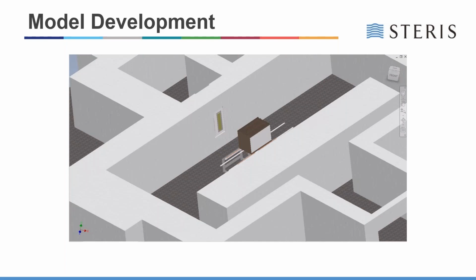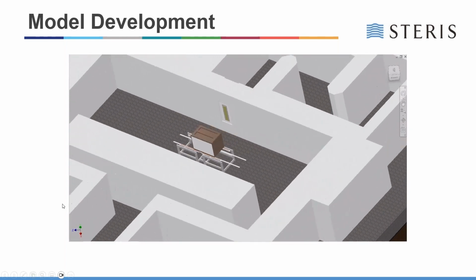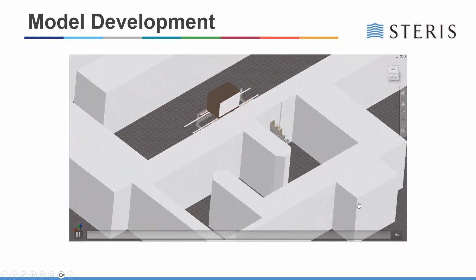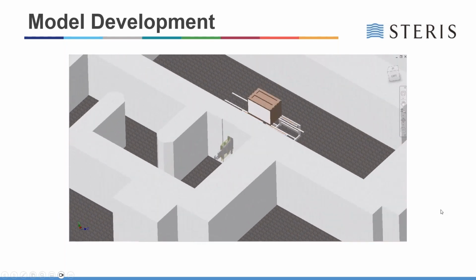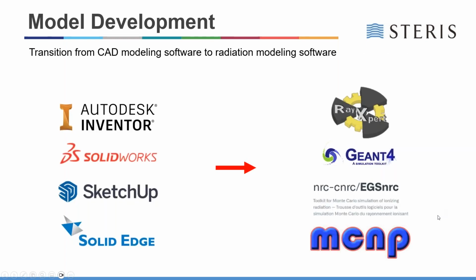The conveyance system directly surrounding the treatment area near the scan horn is included in the model, and the carrier, shown as we circled around it, is filled with a phantom material, and this would be similar to the material that is used during operational qualification or OQ testing. Take one more circle around. But you can see all the different components that go into a model.